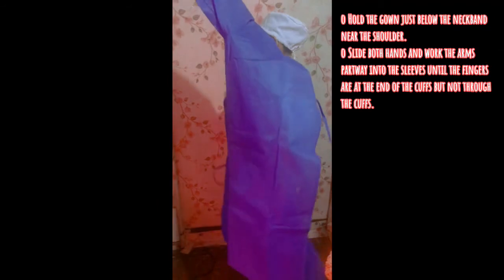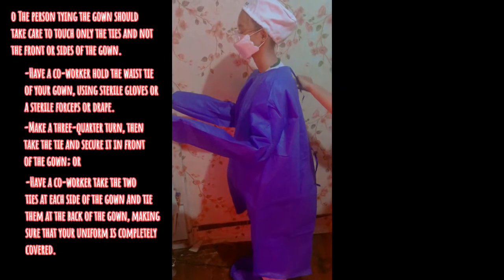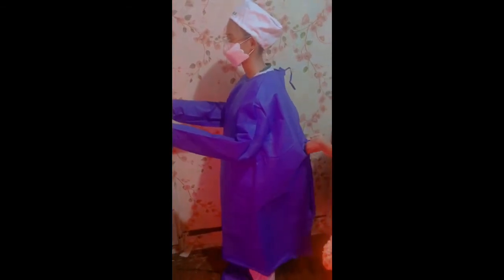Carefully insert the hands and allow the arms to work their way without forcing, to prevent contamination. Having a co-worker help you allows for a more thorough and easier gowning without contaminating by yourself. Tying the gown with the help of the co-worker helps secure the gown properly and completely.